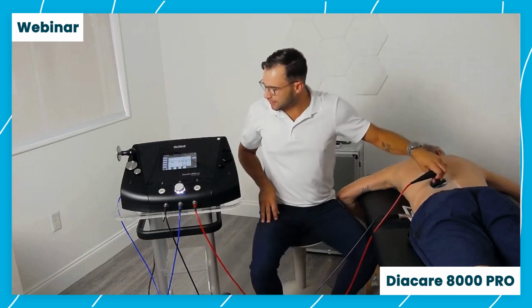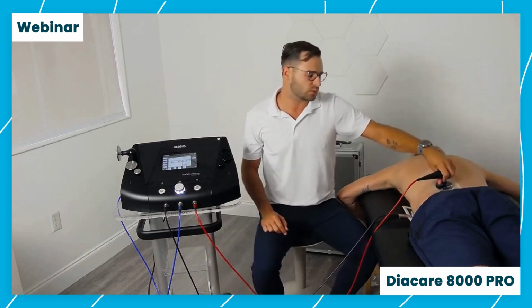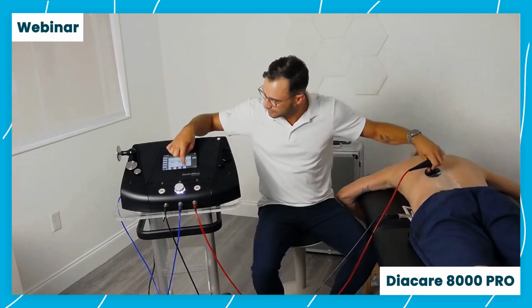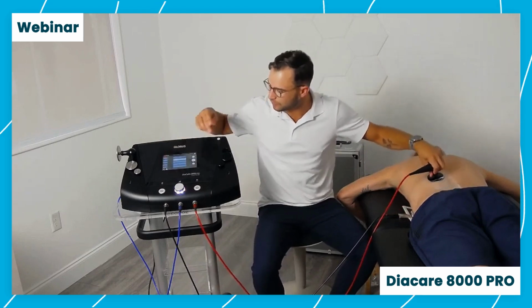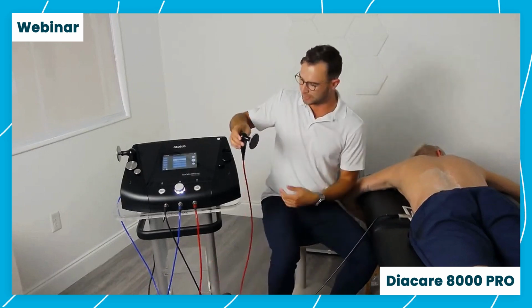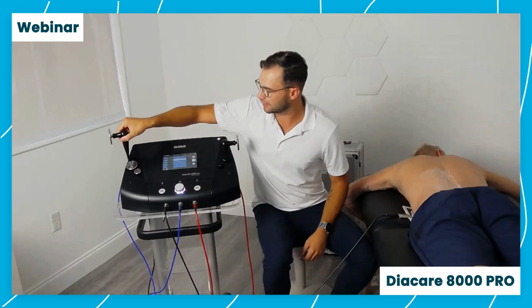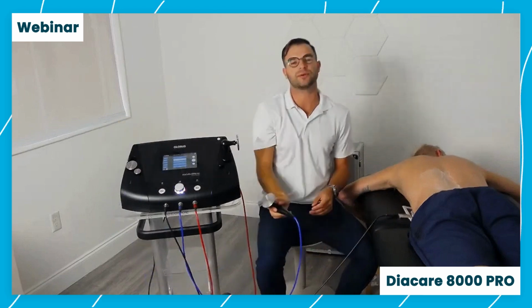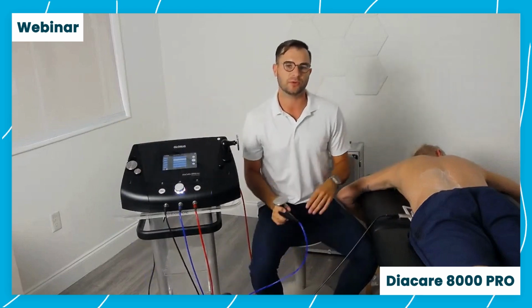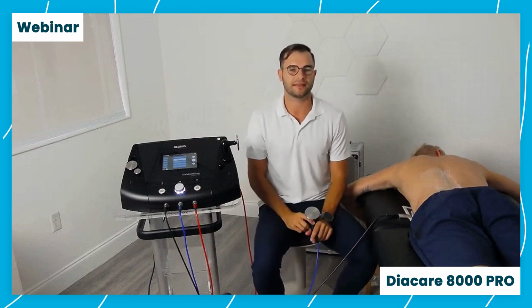So what I like to do is start with the capacitive. Either way, we get those tissues warmed up, and then we can pause, stop, and move to a resistive after that. So you can take it for a couple minutes, then we move on to the resistive side. Again, with the resistive, we're now going to dive deeper into that tissue. We're trying to get down low, maybe into the deeper muscles, towards the joints, and things like that.